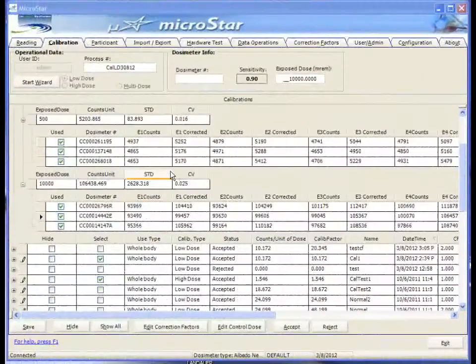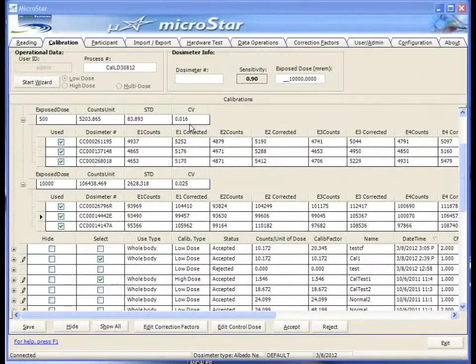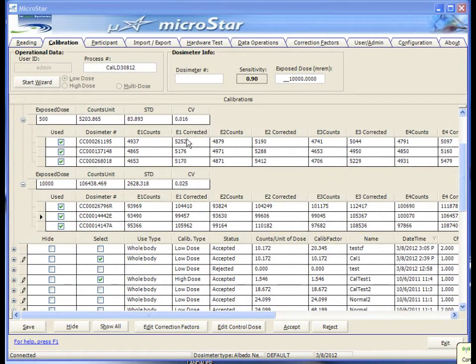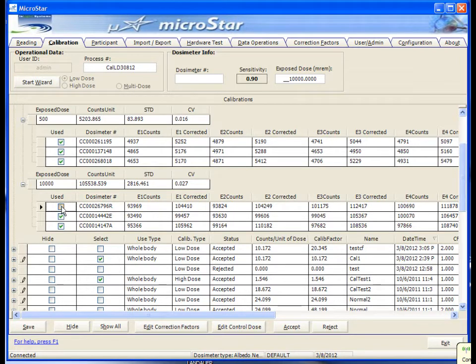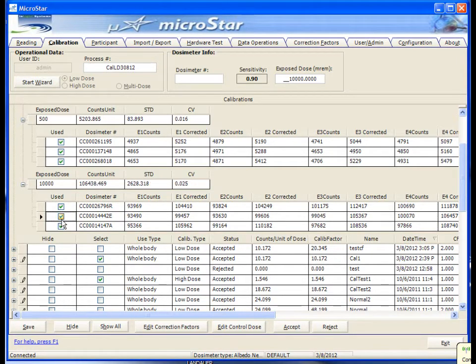Once all the badges are read, evaluate the coefficient of variation for each dose level. The value should be 5% or less. You can choose which badges are used in the calculation by selecting and unselecting them.